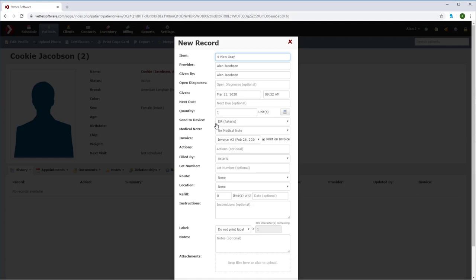you'll see send to device listed as DR or digital radiograph. This means the request, along with the patient information, will be sent to your x-ray units work list. The filled by category is also listed as Asteris, so we can go ahead and finalize this request.